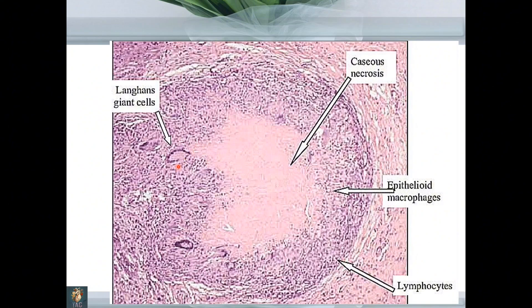In the actual histology slide, you can see Langhans giant cells, lymphocytes, and epithelioid macrophages. There is a central amorphous pink-colored tissue — that is caseous necrosis — where you cannot appreciate any cellular detail. Langhans giant cells, lymphocytic infiltration, epithelioid macrophages, and central caseous necrosis: that is the complete picture of granuloma due to Mycobacterium tuberculosis infection.